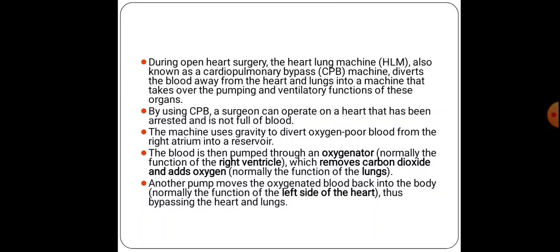Then, with the help of the pump, we pump the oxygenated blood to the body again, which is the function of the left side of the heart. So with the heart-lung machine we can perform maximally the same function as the heart.